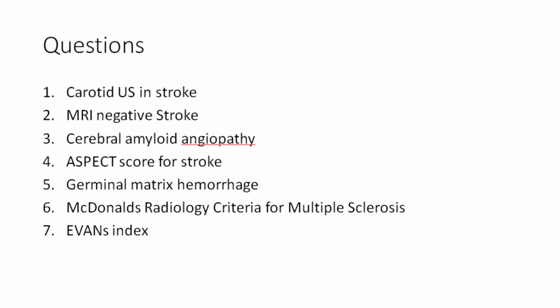Evans index, who knows about that? Another common mistake that I come across. Who knows about the Evans index? One. There's just one person. Okay. Who else? Evans index. Every report says small vessel ischemic changes, normal pressure hydrocephalus. Wrong. Did you do Evans index?